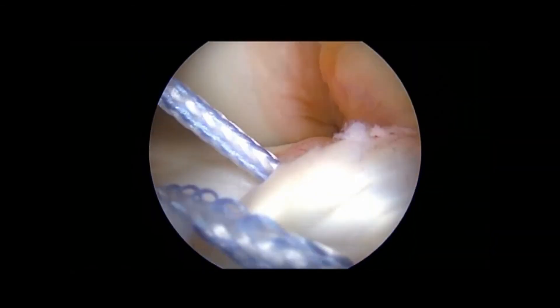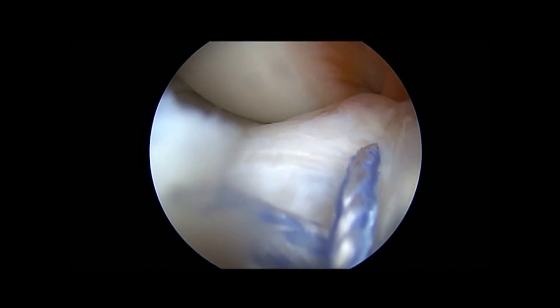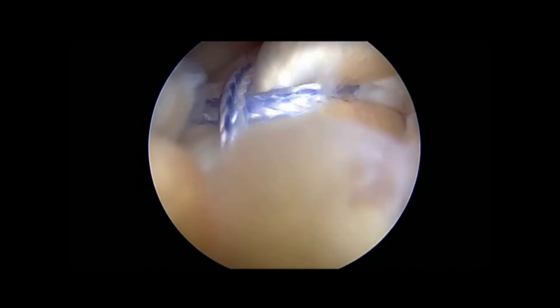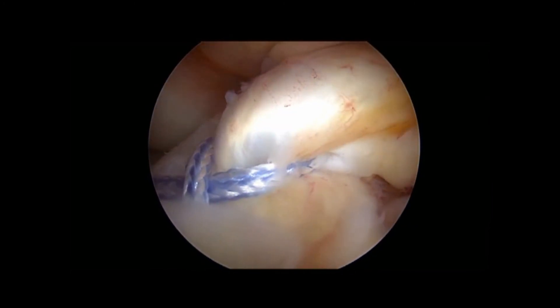I cross it so that the lateral part goes medial and vice versa. This is the final result.